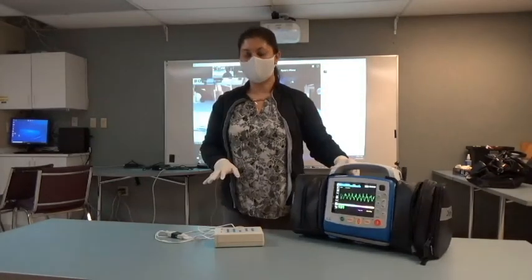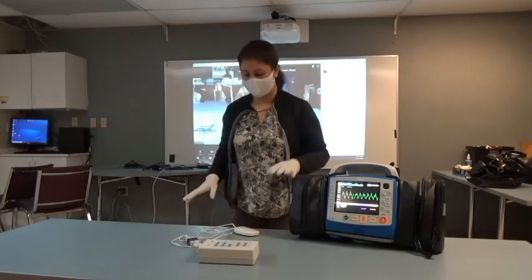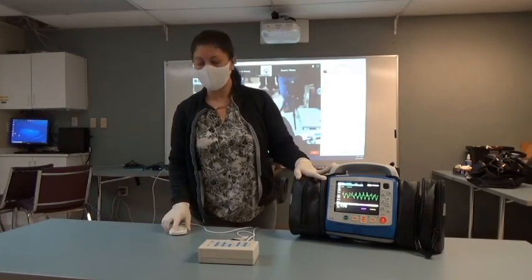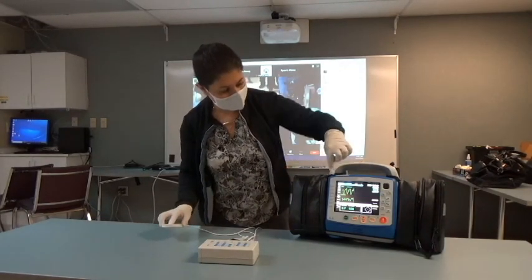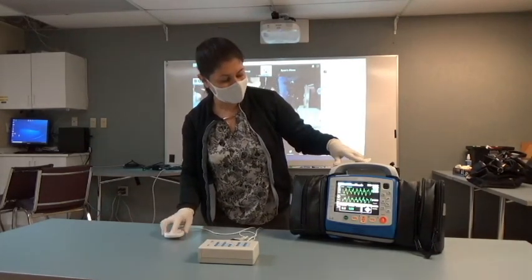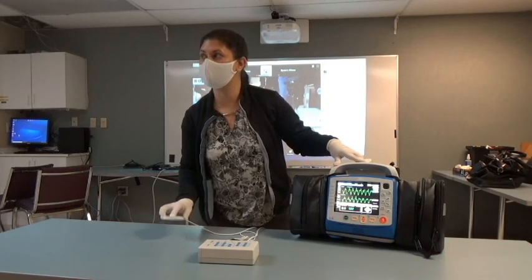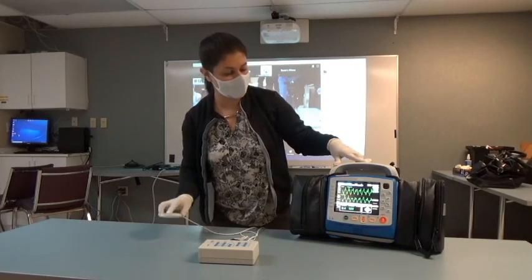So this is basically what the CPR puck is going to give you. And I don't have it facing me, so I'm going to try my best to keep in time with it. But this is an accelerometer, so it measures this going up and down, okay? So as we start to do our compressions, the first 5 to 8 compressions are free. There's my dashboard. The first number is the depth. The next number is the rate. The bar should go up to the top. That's my recoil velocity, how fast I'm coming off the chest. The diamond is the perfusion to the heart, and then I get a clock above it to tell me when to switch out compressors.